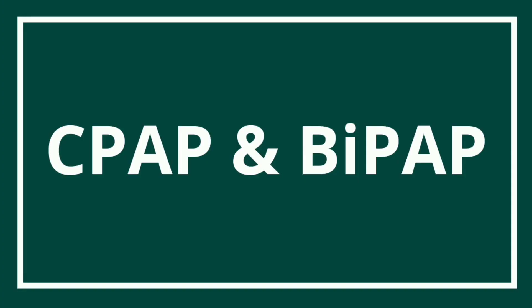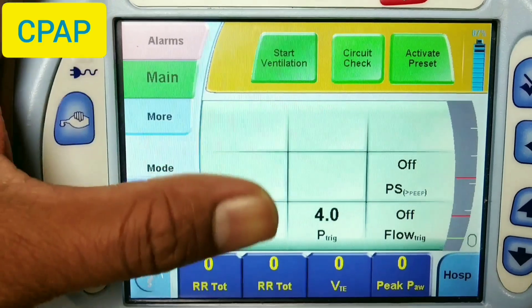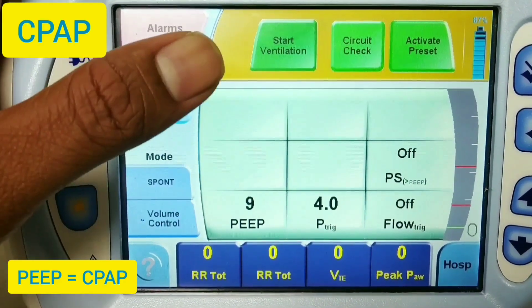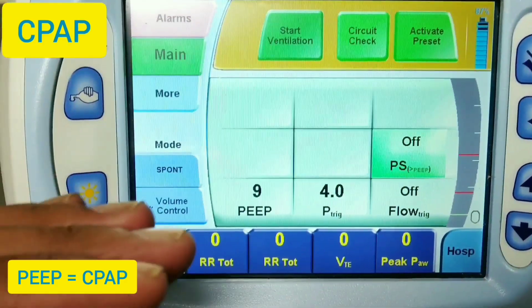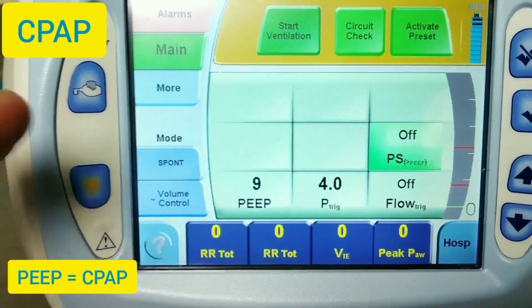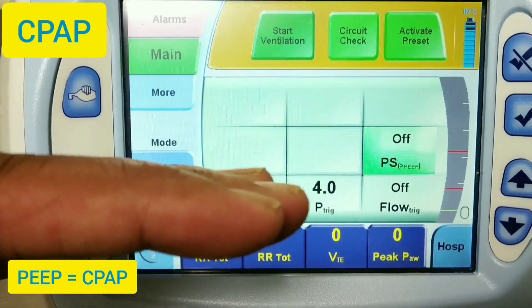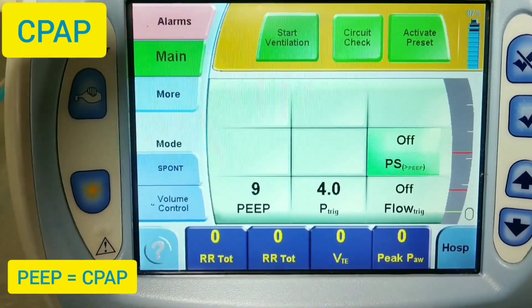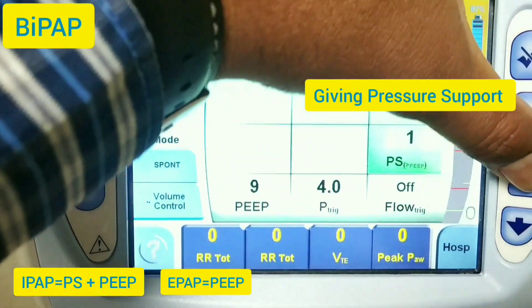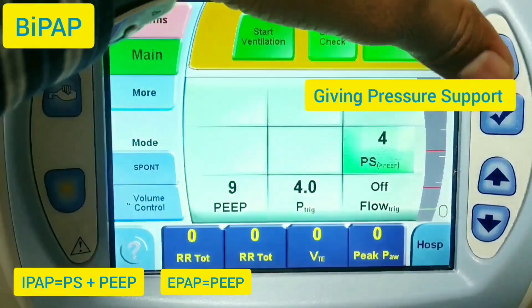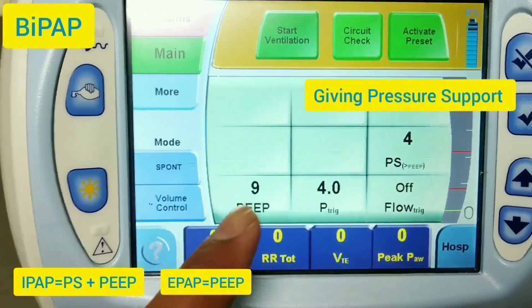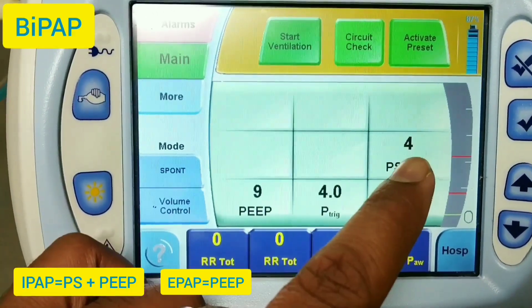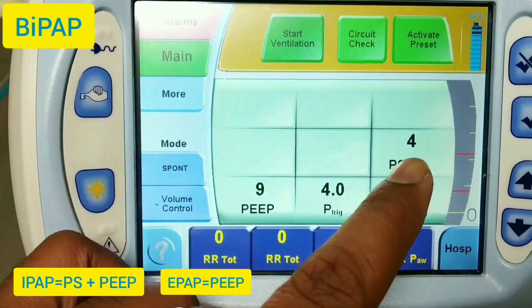Now let's look at the CPAP and BiPAP settings. For CPAP mode, we only set the PEEP and keep pressure support off, so there is only one pressure level — the PEEP equals CPAP. By adding pressure support, we create two pressures: IPAP equals pressure support plus PEEP, and EPAP equals PEEP, which gives us BiPAP.